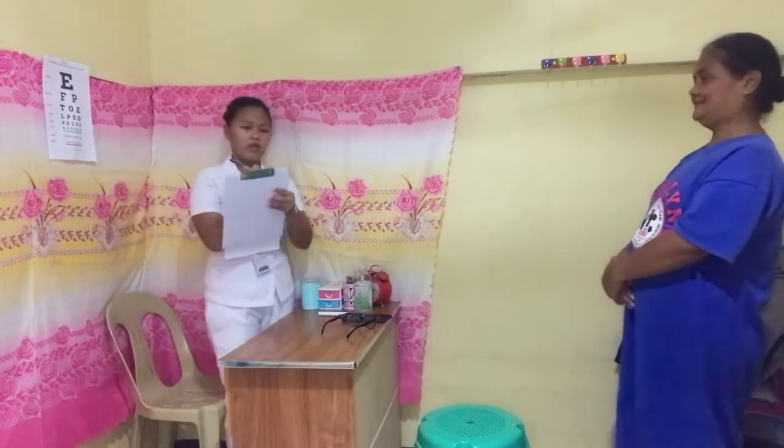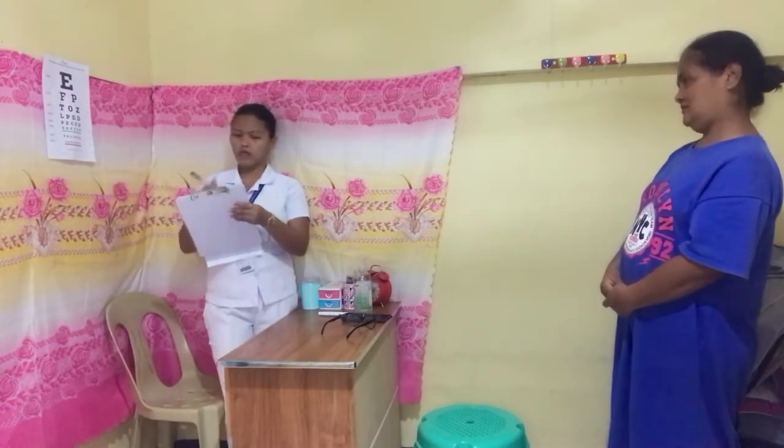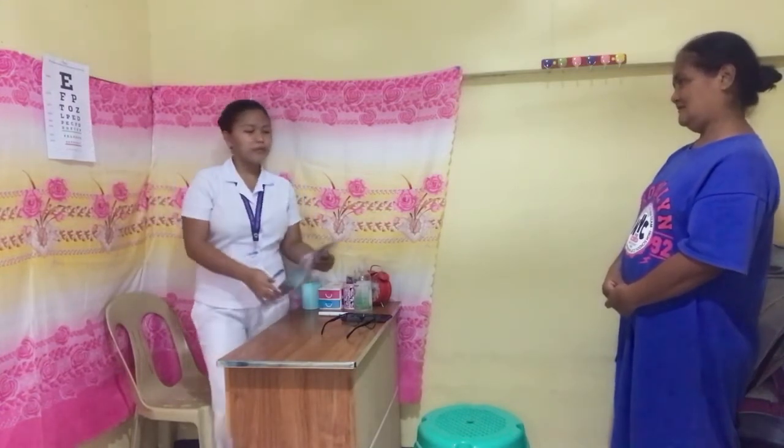Okay, thank you. Now, try reading it with both eyes. E F P T O Z L P E D P E C F D E D F C Z P F E L C P G P Z D. Then I cannot read. Okay, thank you.